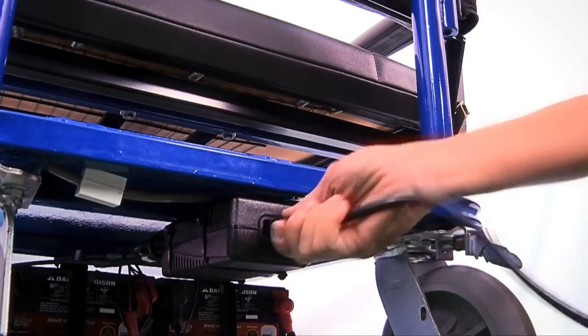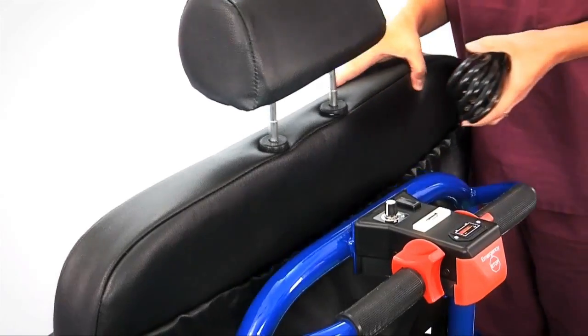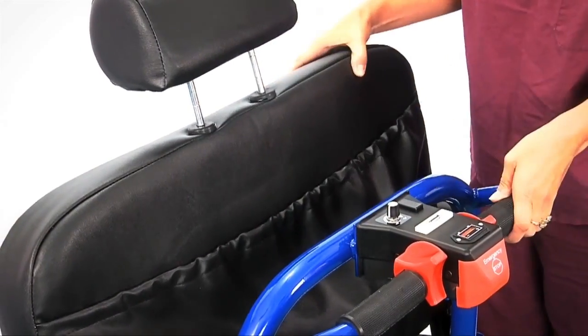The Breeze has a smart charge system to eliminate overcharging of the batteries. The Breeze can be recharged whenever it is not in use. Always remember to remove the power cord and stow it when charging is complete and you are ready to use the unit.